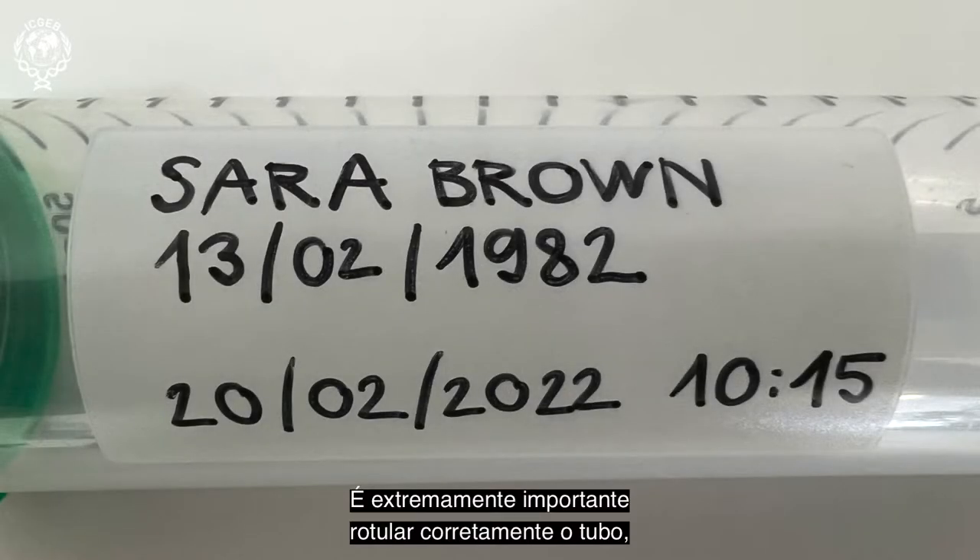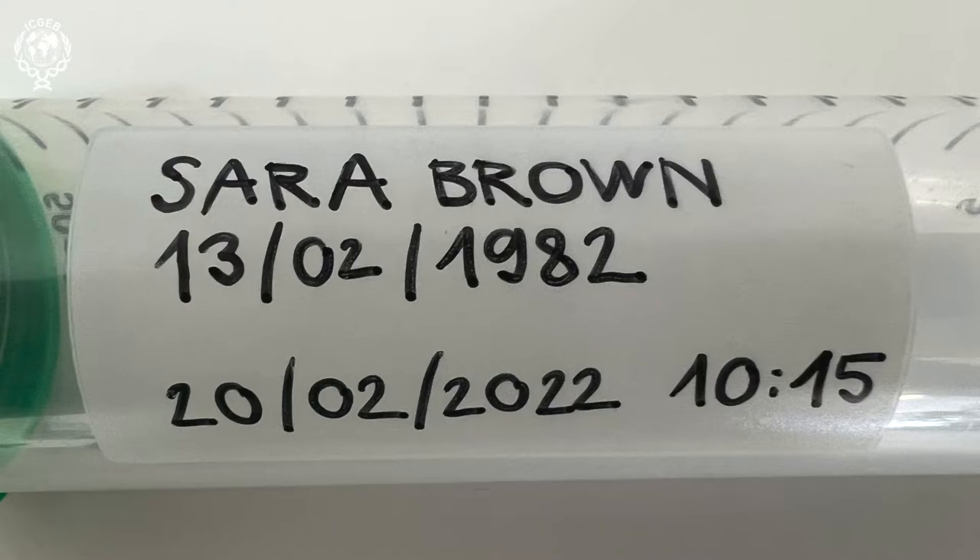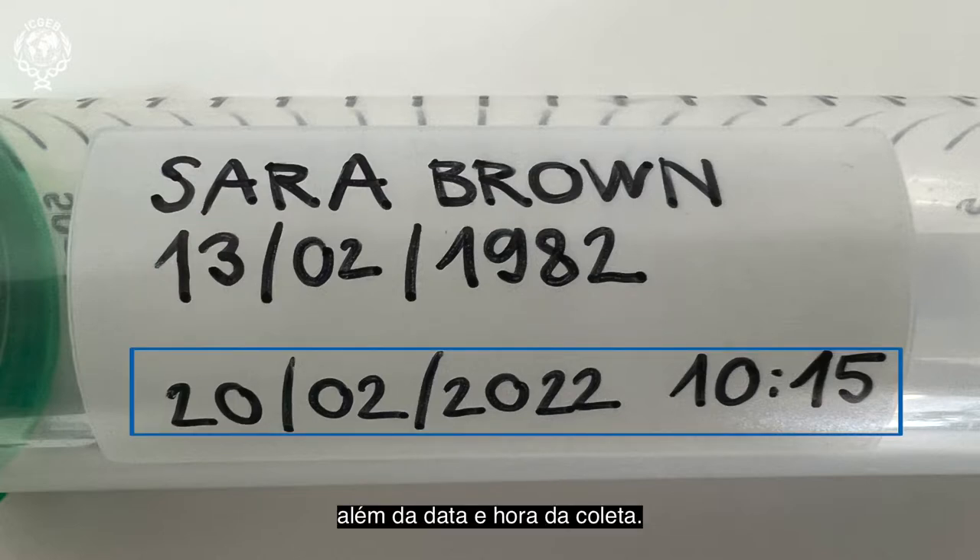It is extremely important to correctly label the tube, especially with information to uniquely identify you. Key information includes your full name, date of birth, along with the collection date and time.